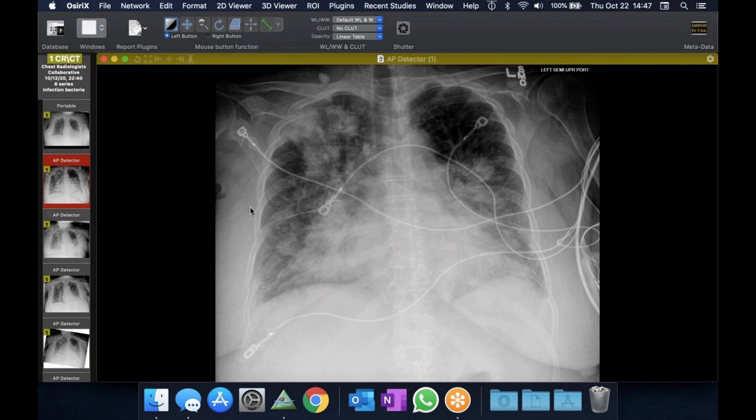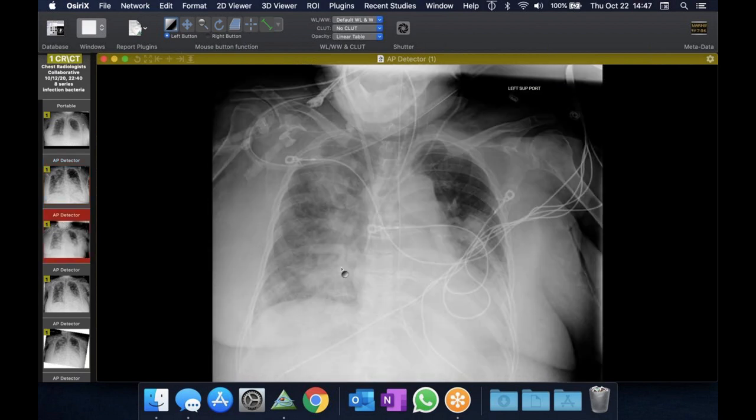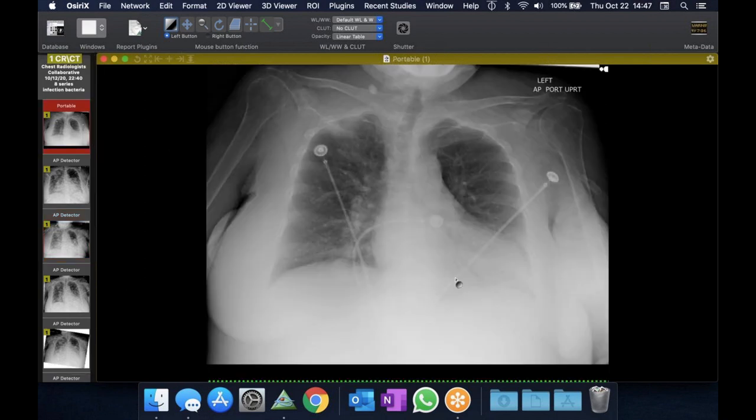And then finally, this was the radiograph where the patient becomes intubated. You can see rather extensive lung disease. When I see rapidly progressive consolidation that starts as what appears to be unilateral or mostly unilateral and rapidly becomes bilateral, the one thing I remember learning from David was to always think about Legionella. And so this is Legionella pneumophila.